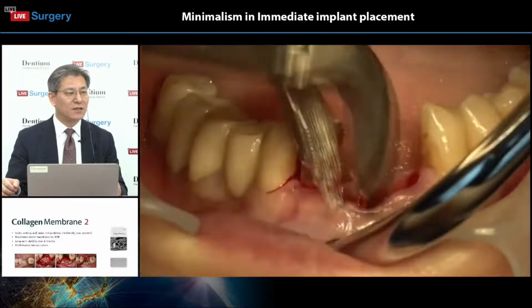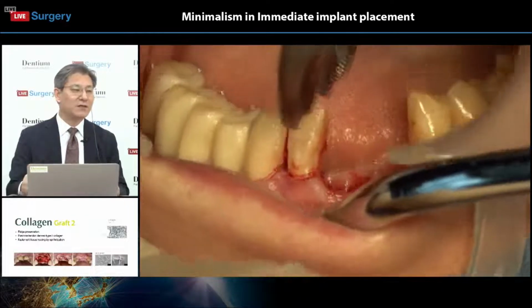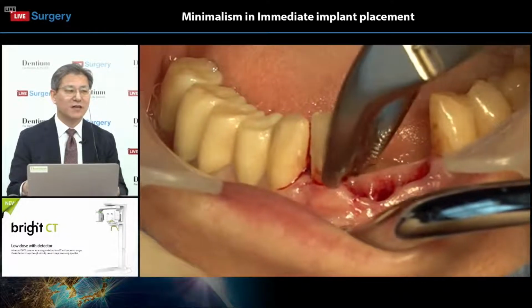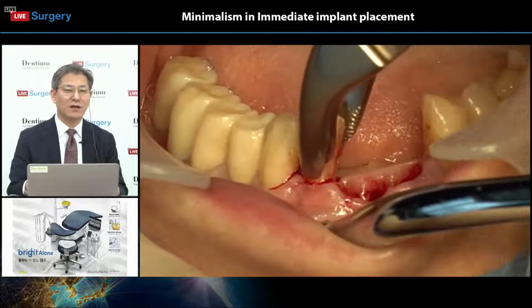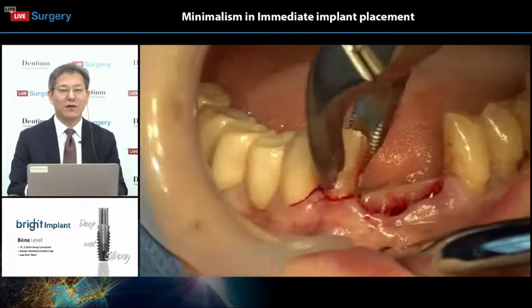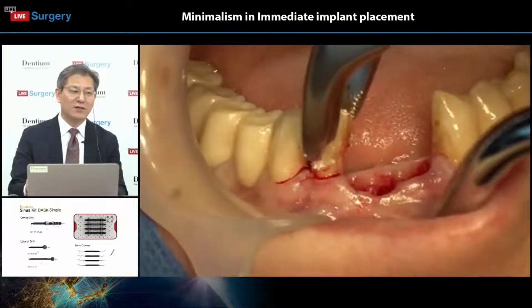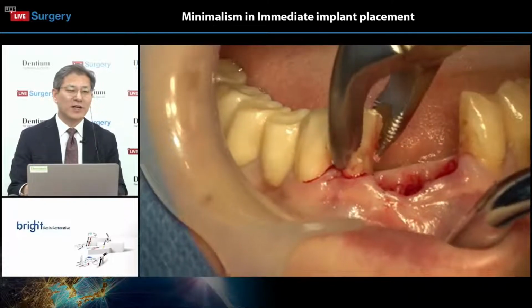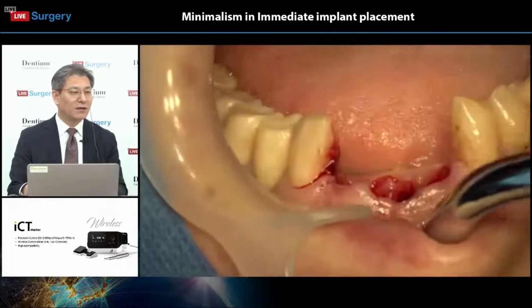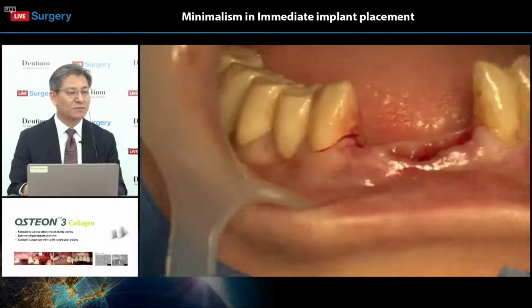So sometimes it is very slippery because of live surgery, as you know. All of these live surgeries have some limitation of side view because of the camera angle. So the operator is checking the angles of the camera. Sometimes the instrumentation will be difficult. So anyway, the ordinary extractions were done.